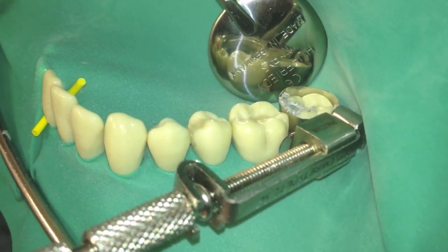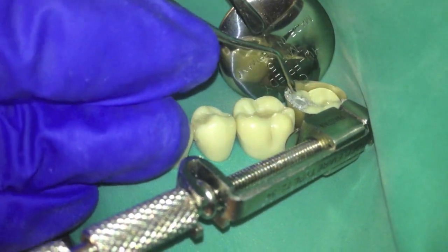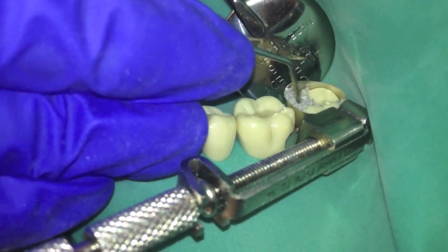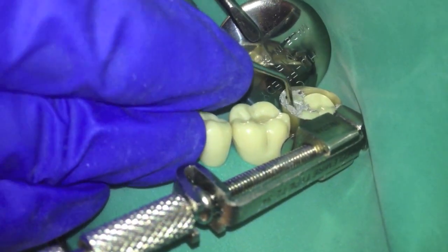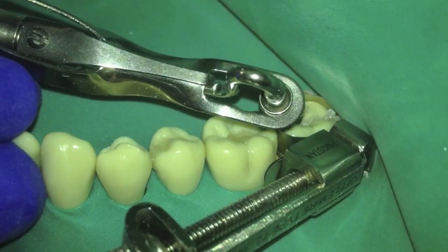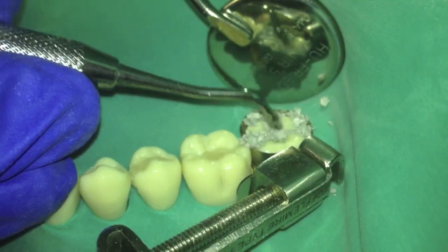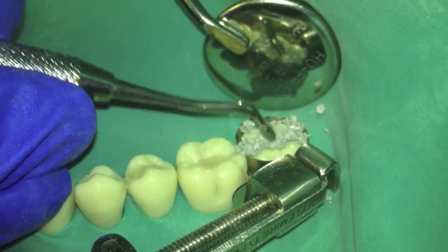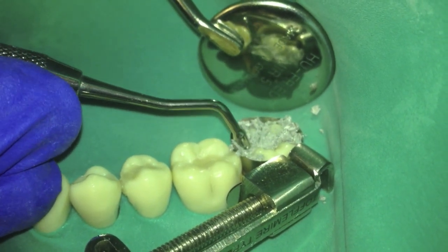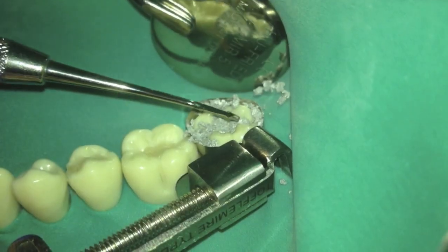The amalgam is placed in the deepest portion of the box first. Force is used with a small amalgam condenser in an apical, buccal, and lingual direction. The amalgam is also condensed towards the matrix band to ensure proper contact. Overpack the preparation with 1-2 mm of amalgam.